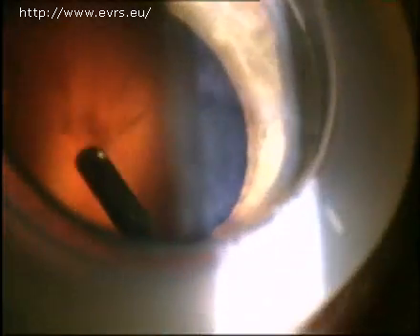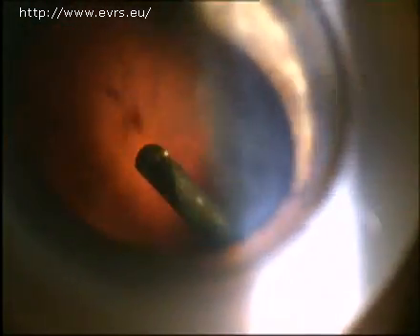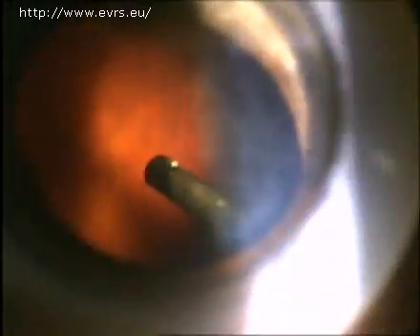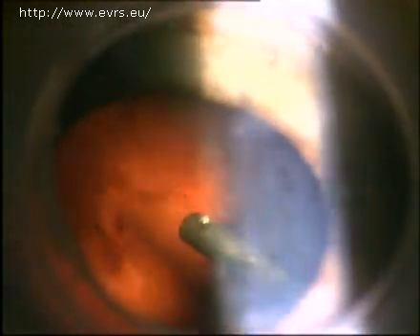This is a phakic eye, so a manual indentation is called for. With a vitreous of average periphery, I usually work between 6 and 8 cc per minute, and then, when I want to remove the last peripheral remainders, I lower the level to between 2 and 4 cc per minute.